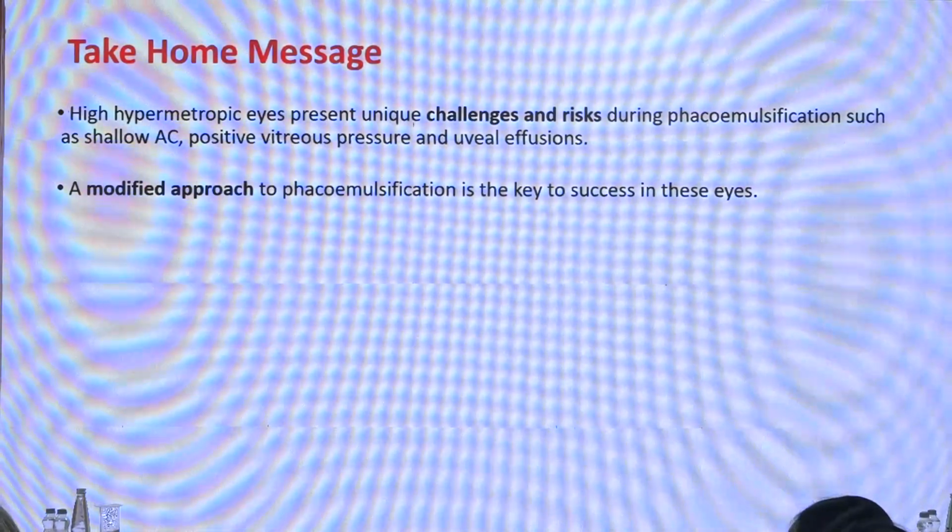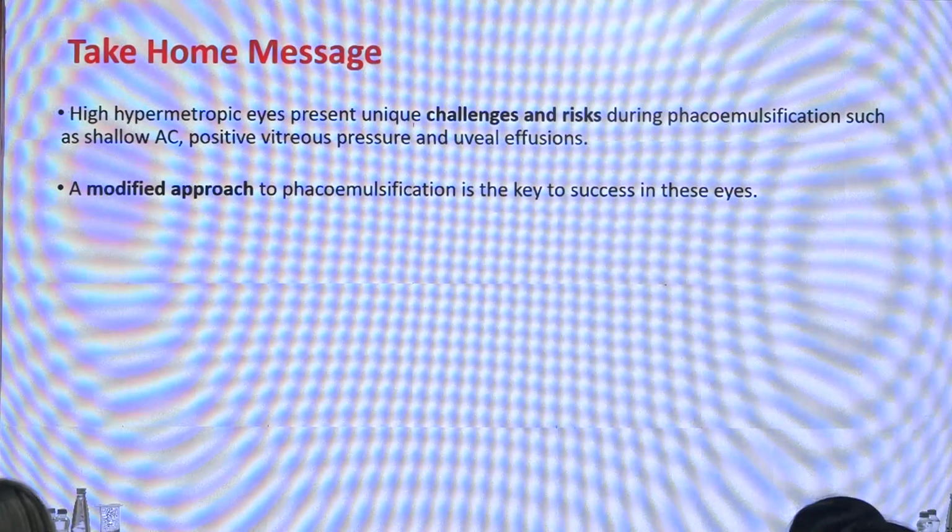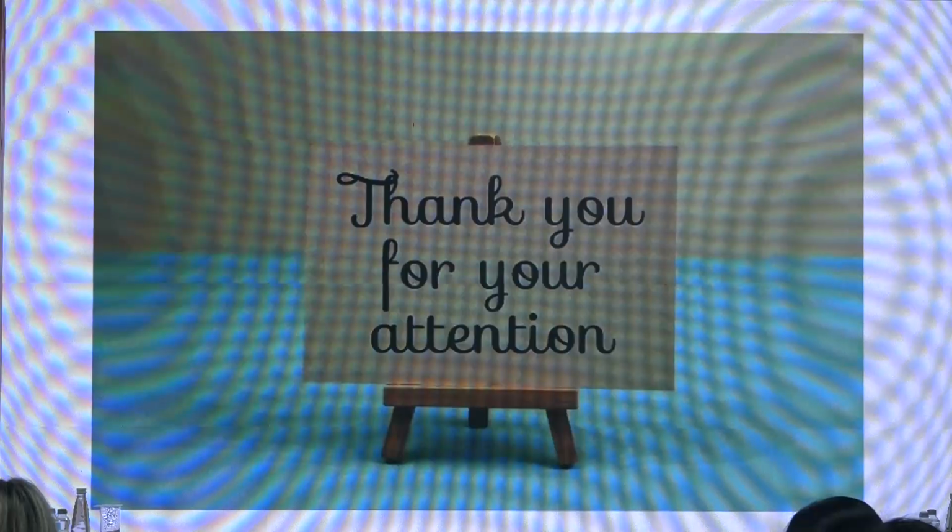So my take-home message would be, high hypermetropic eyes present unique challenges and risks during phacoemulsification, such as shallow AC, positive vitreous pressure, and uveal effusions. A modified approach to phacoemulsification is the key to success in these eyes. Thank you.